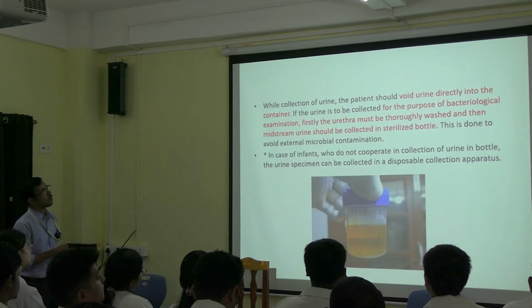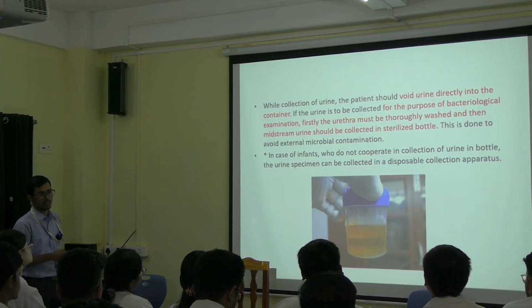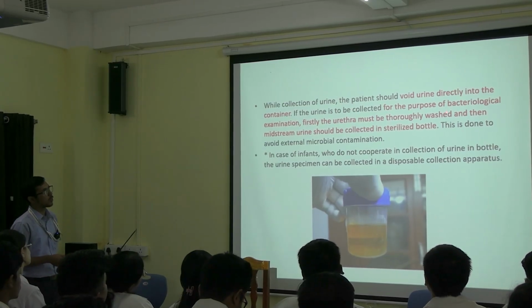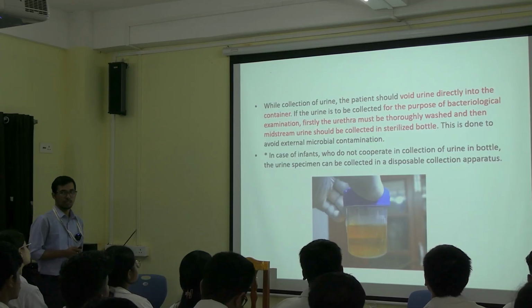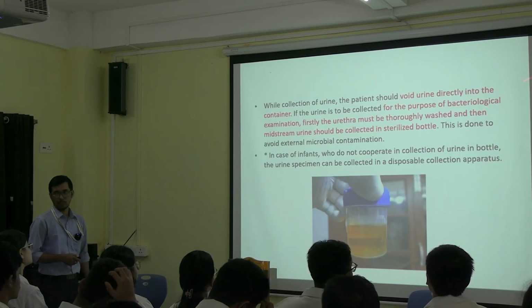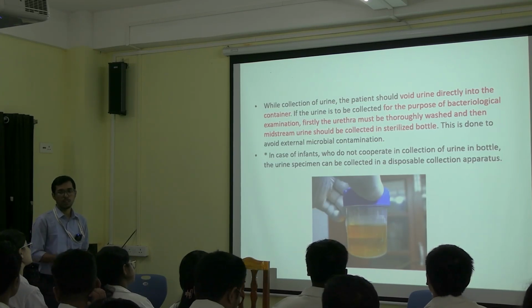While collecting urine, the patient should avoid contaminating the sample. If the sample is collected for bacteriological examination, firstly the urethra and perineal part must be cleaned thoroughly, so that the normal commensal bacteria present in the perineal area won't contaminate it.